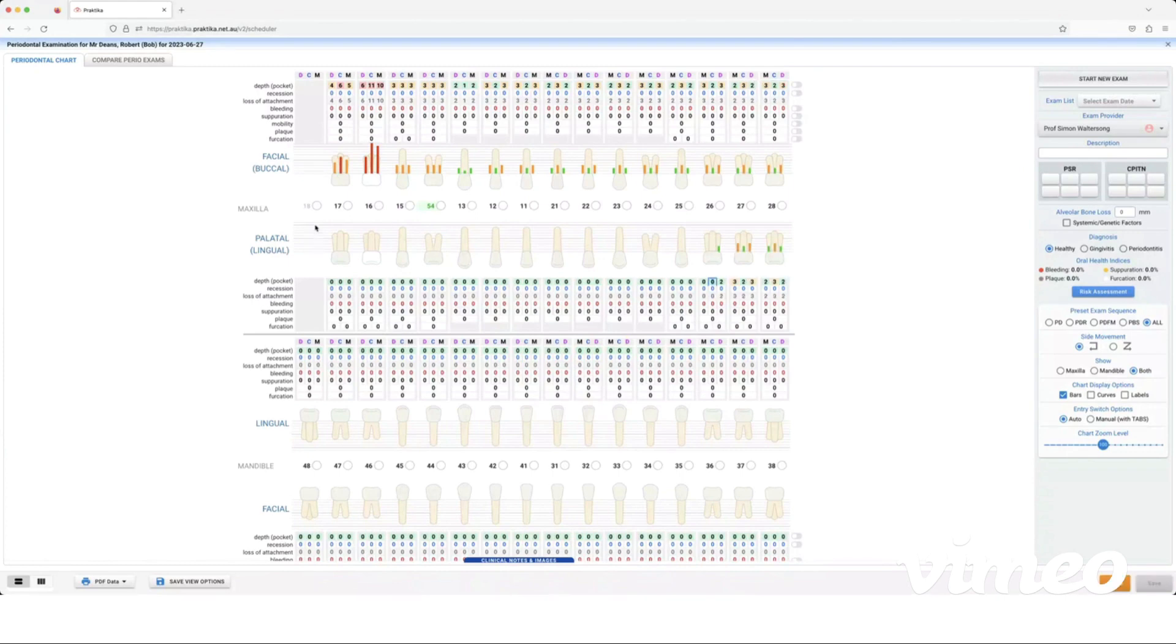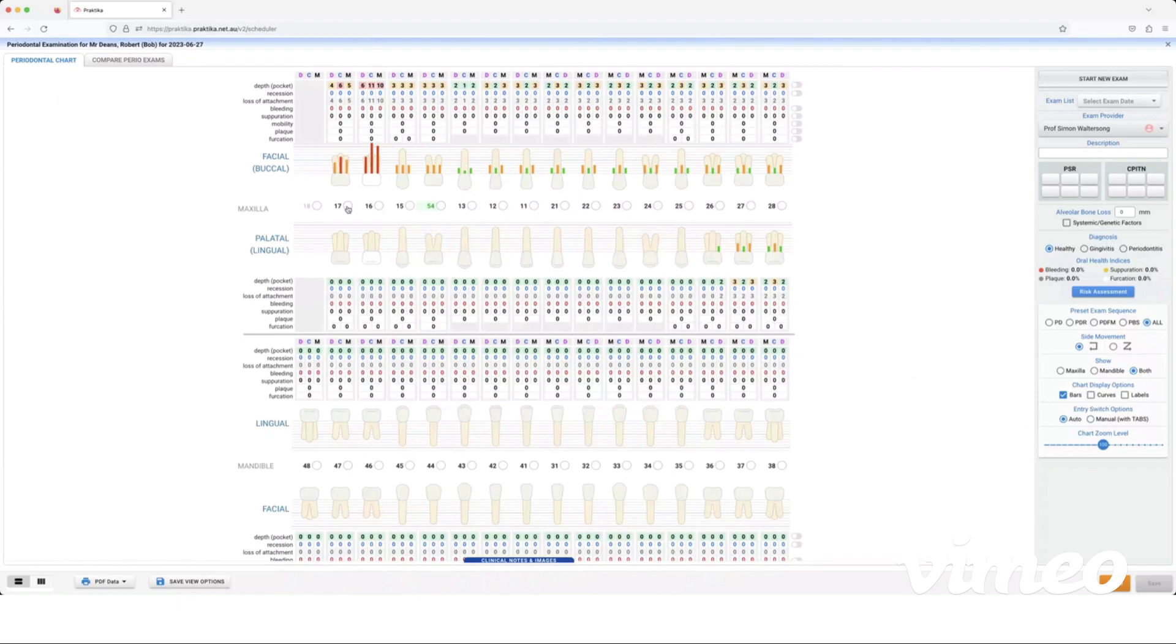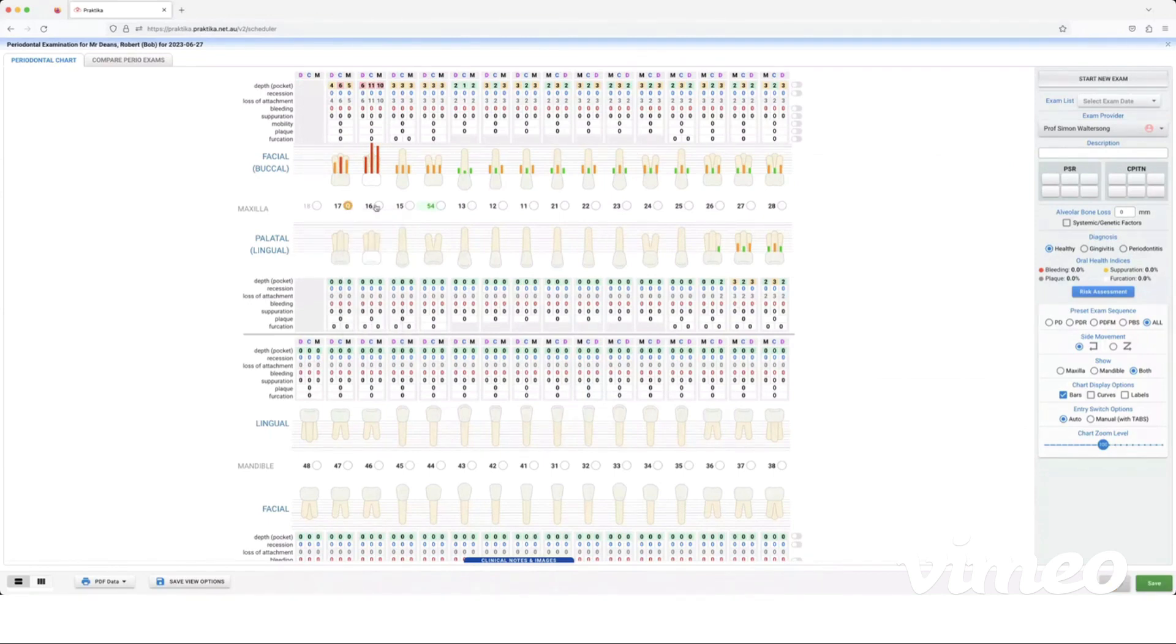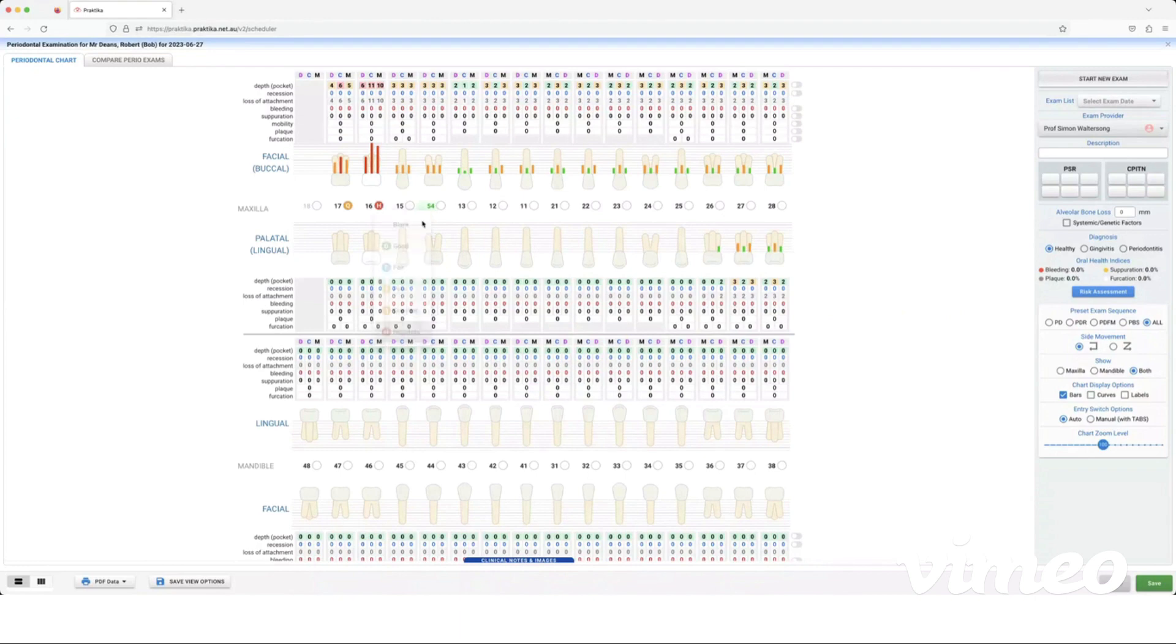Now I have the option in here to mark each individual tooth as a prognosis. So I can mark it as a questionable prognosis if the tooth has extremely high pocket depth or is quite mobile. I can go through and mark each individual one here. You don't have to do this but this is an option if you want to.